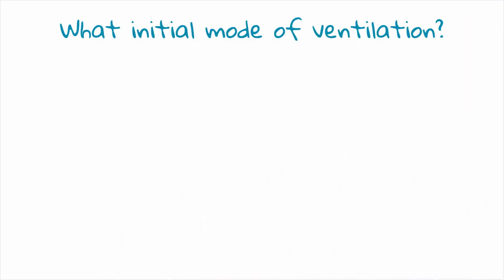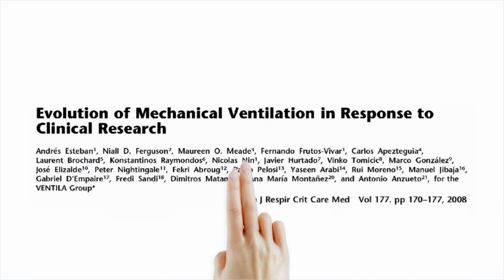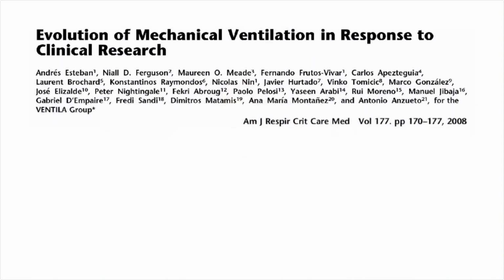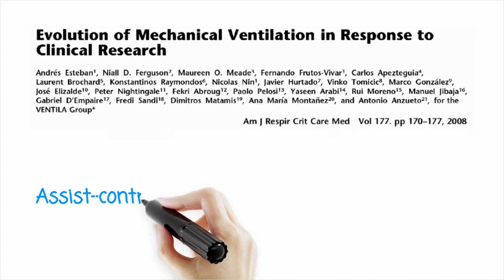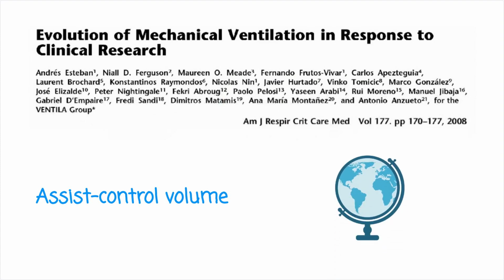Let's discuss which initial mode of ventilation should be selected. Although there are numerous options for selecting the initial mode, assist controlled volume ventilation is the most common ventilator mode used throughout the world as a primary initial mode of ventilator support.